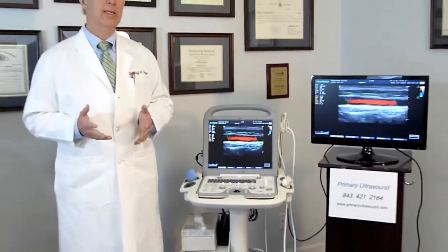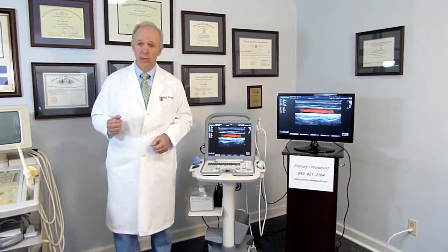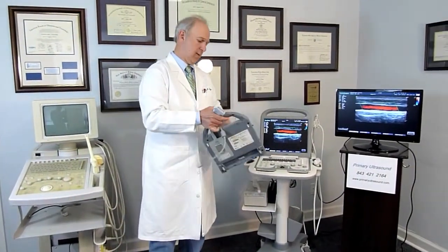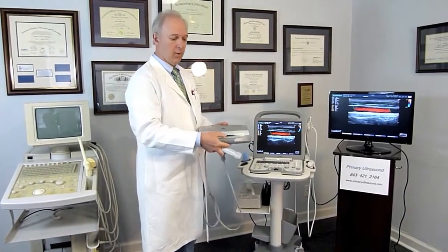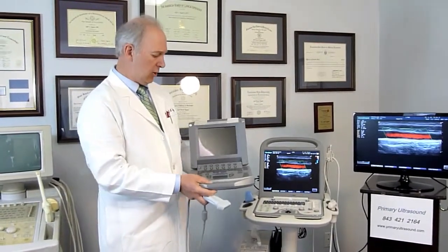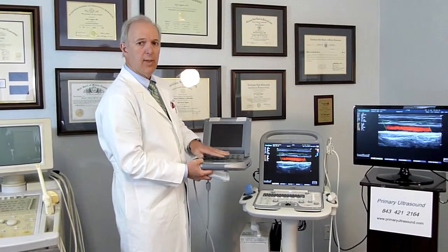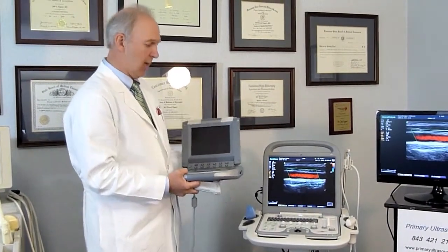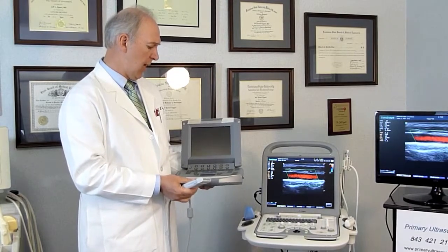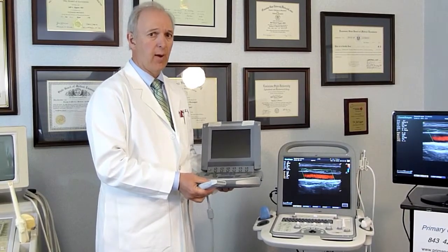Another advance in ultrasonography was the development of the very compact ultrasound. This was the first portable color Doppler ultrasound that I had. It had good image quality, but there are some compromises: the screen is small, the keyboard is small, and it only takes one transducer at a time. The biggest complaint I would have is that I've had some problems with reliability, and the cost of repair has been very, very high.